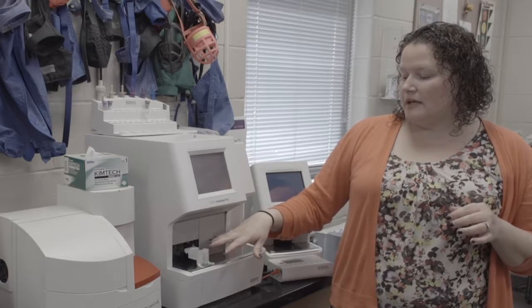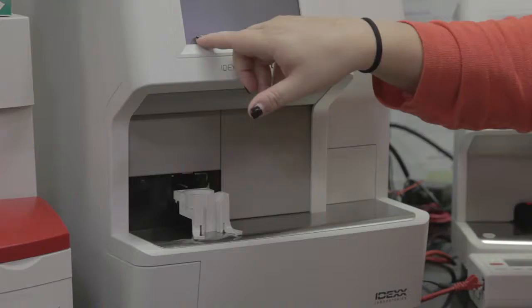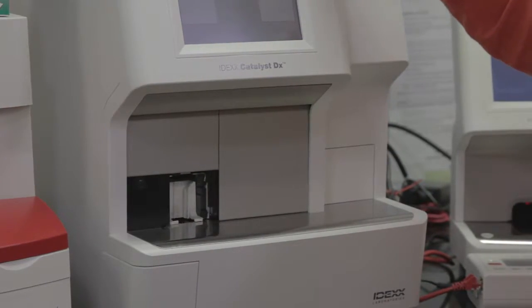And then if you throw a thyroid into the mix, into any of this, it just makes everything 15 minutes regardless of what sample type you're using. Okay? All right.